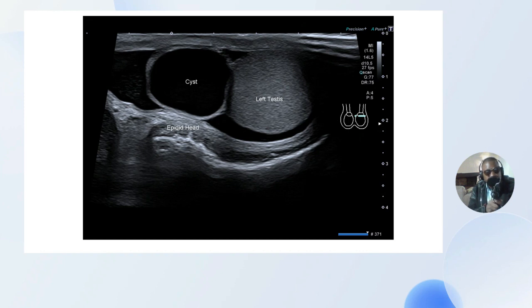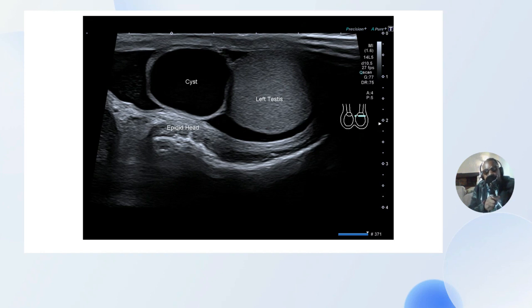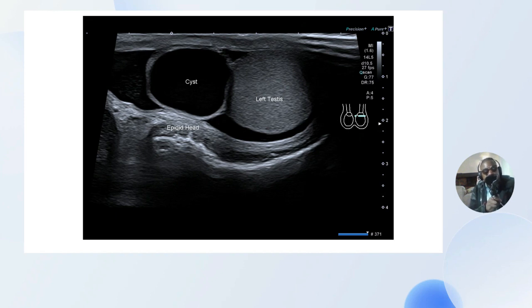You can see that the walls of the cyst are thin and very well outlined. When you are doing your examination you must make an effort to visualize the pathology in two dimensions, and then make sure the lesion is examined using both color and power Doppler. Fortunately here you can see that it's not a suspicious lesion — it's just an extra-testicular cyst in the head of the epididymis.